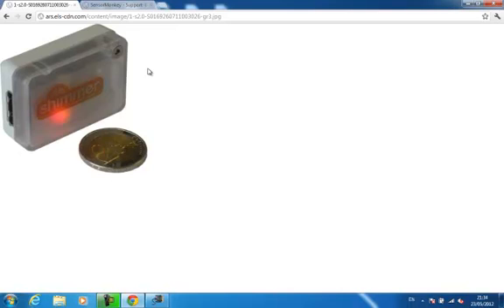To start, I have placed the Shimmer in the USB charging dock connected to my computer. I am now going to upload the appropriate firmware to the device using the standalone Windows Bootstrap loader provided by Shimmer Research.